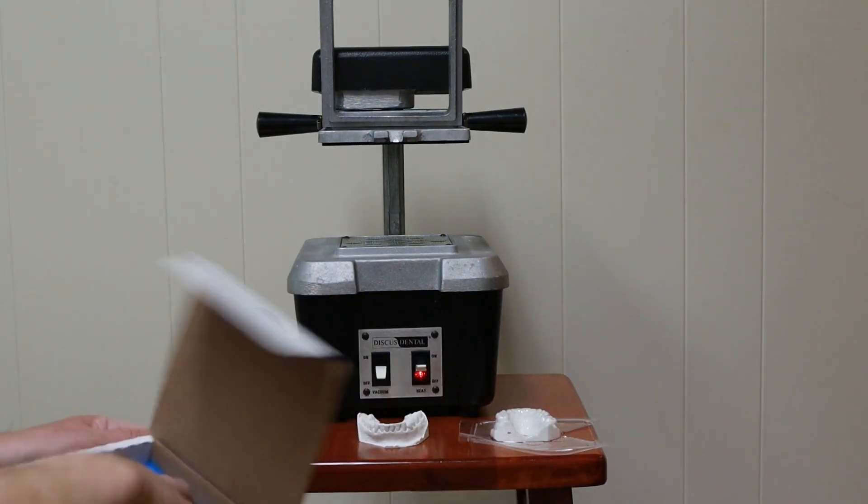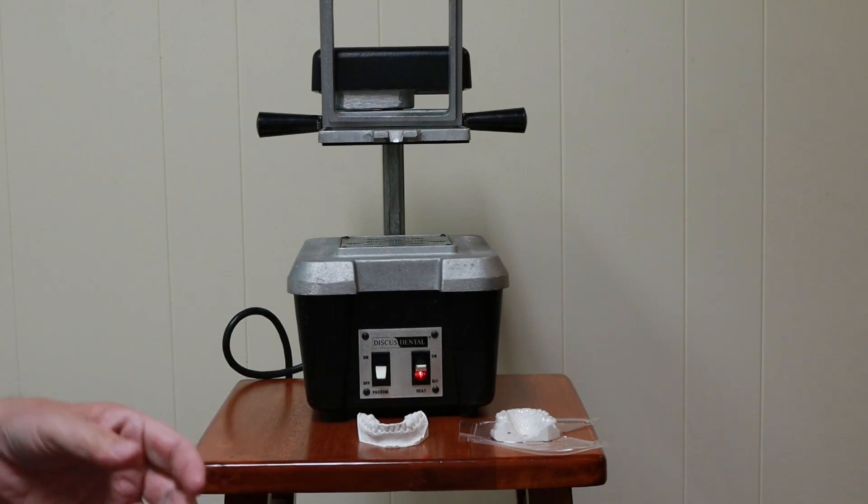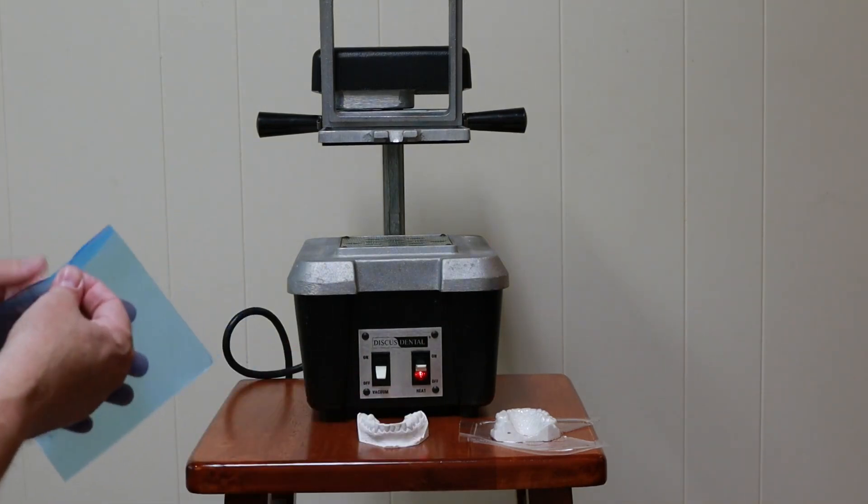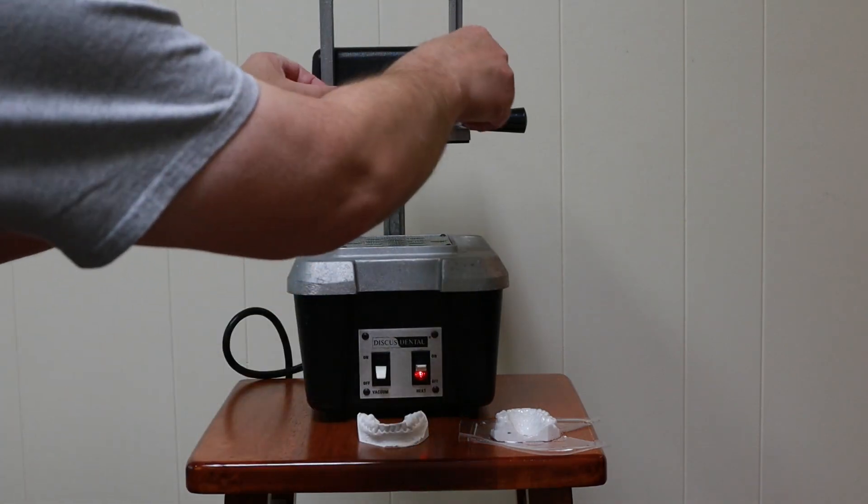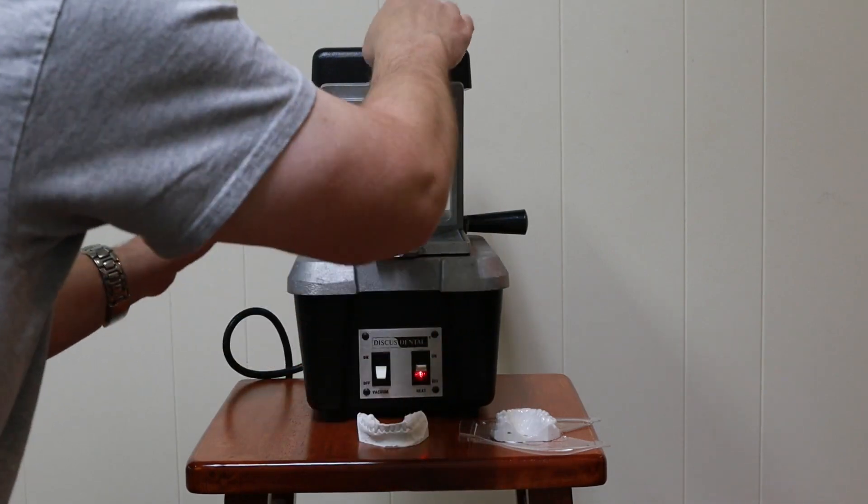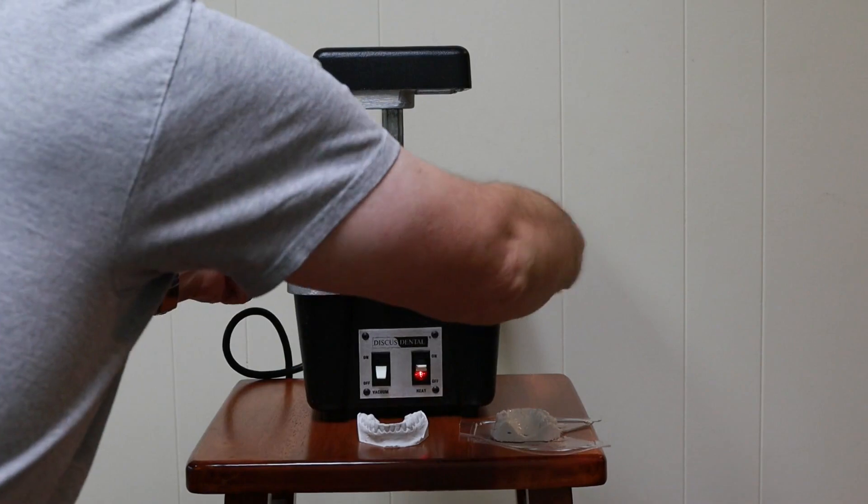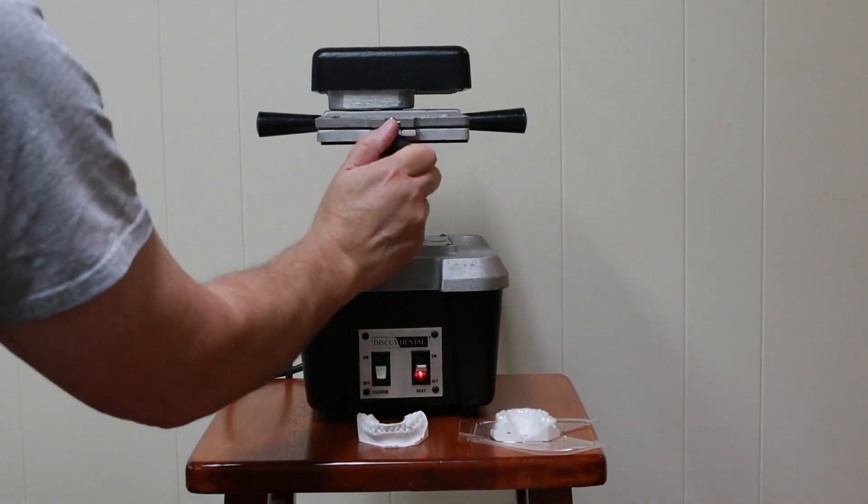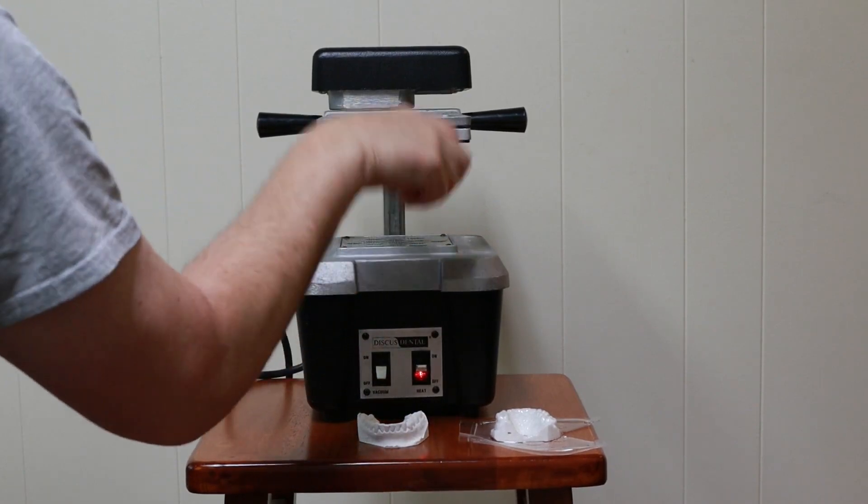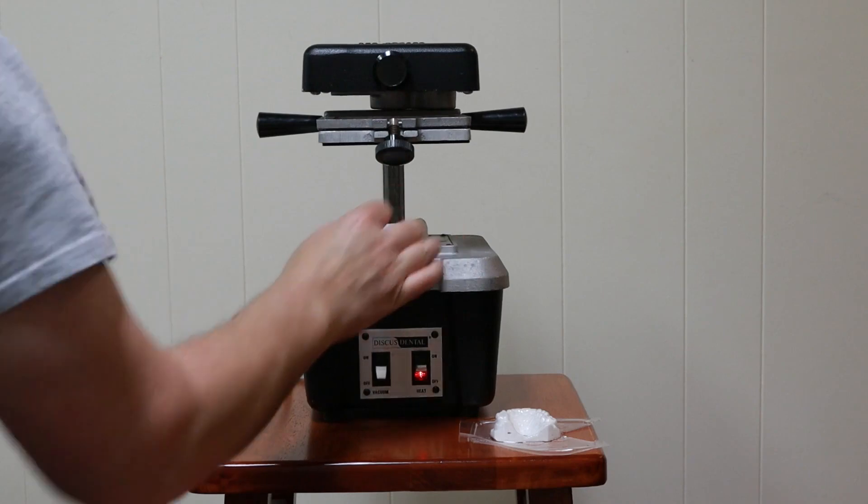Let's get another sheet out of the package. Lock it in place. Rotate the heat source. Place the model underneath.